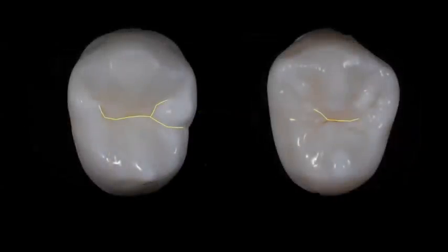Same thing happens with the premolars. The first premolar and the second premolar have differences, different anatomical features. And again, if you learn them by heart and you keep them in mind, all you have to do is try to reproduce this within your layering technique. And that's really what we're talking about today.